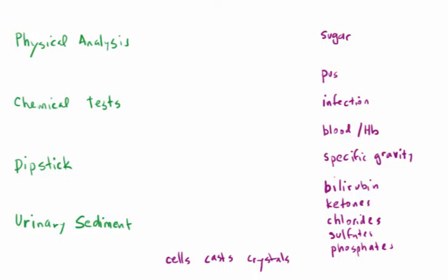And I just want to show you the connections that we're making here. Actually, some things like sugar are being tested for in a couple of ways. For example, we'll be doing a regular chemical test, the normal Benedict's reagent test that we've been doing pretty much all semester long. We also get a read for sugar using the dipstick test. So dipstick and Benedict's are both going to contribute to a call of whether or not we've got sugar in the urine sample.